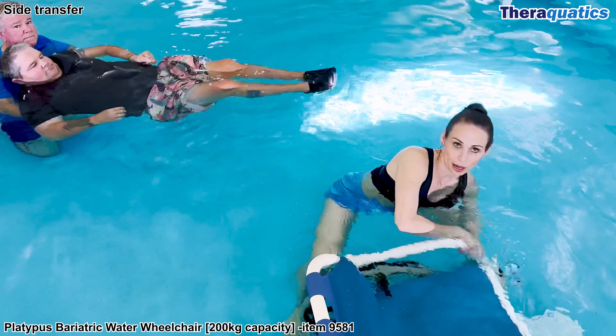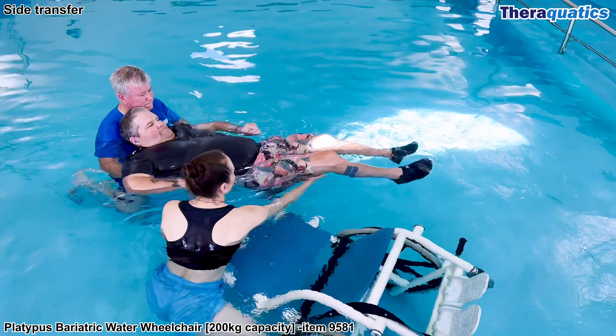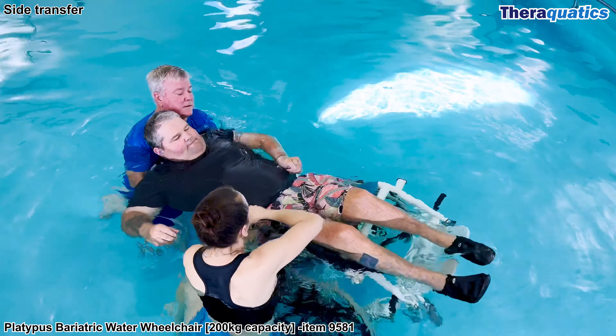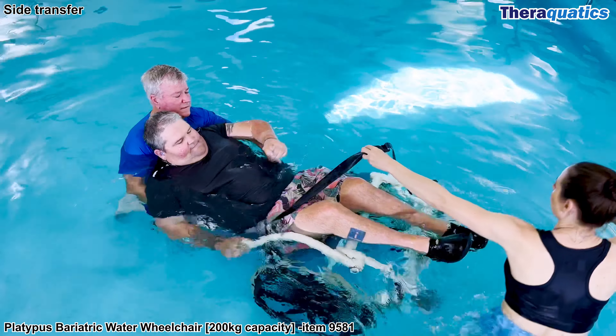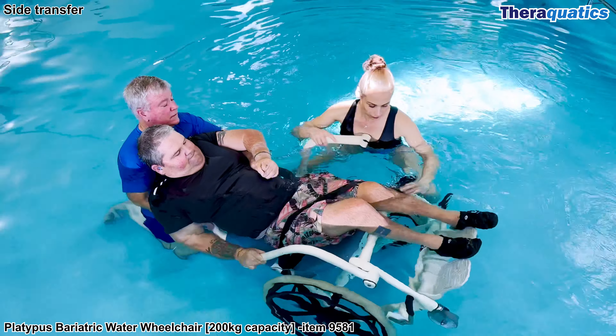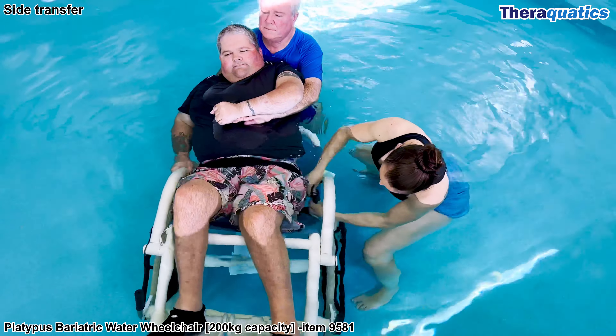This high quality water wheelchair has a swing-away armrest for side transfers. The support person floats the swimmer across and over the wheelchair. The width of the seat is 54 centimetres and can carry a maximum of 200 kilos. The swing-away armrest is clipped back into place and the seat belt is secured and adjusted.